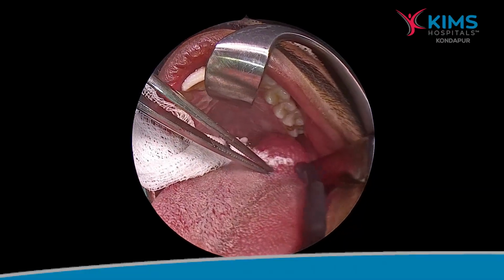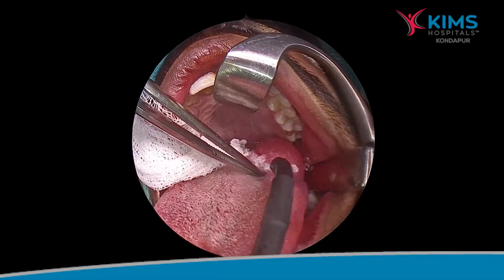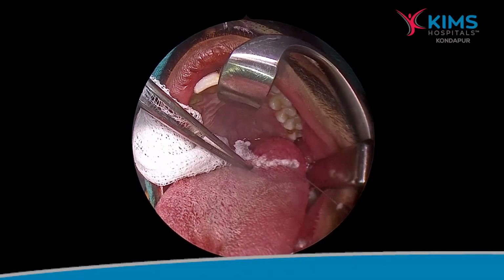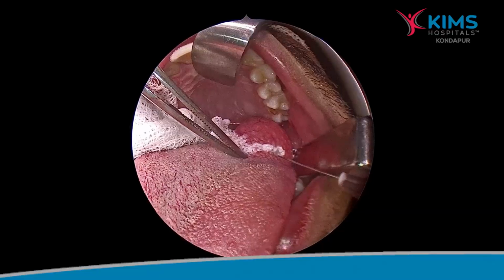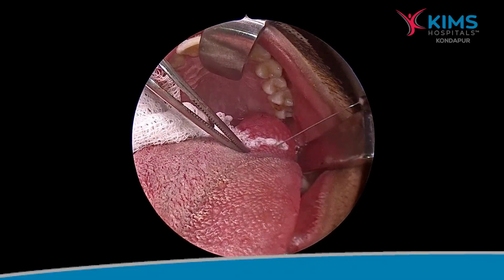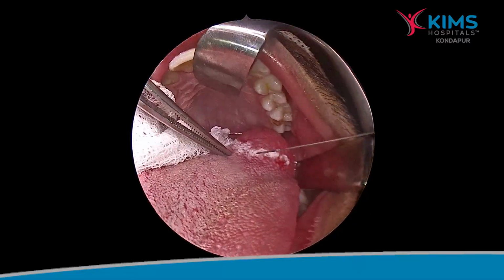This is how the cauterization is going with the Coblator wand. We used the coagulation mode, not the ablation mode here. A little bit of infiltration with 2% xylocaine with adrenaline is given to prevent vascularity or bleeding during the excision of the tumor.